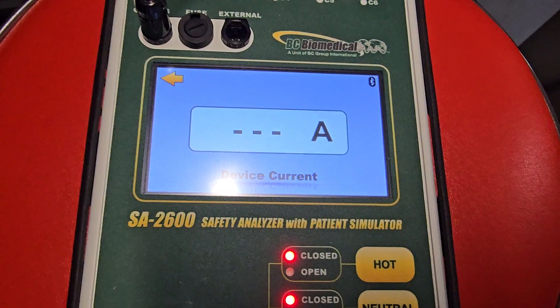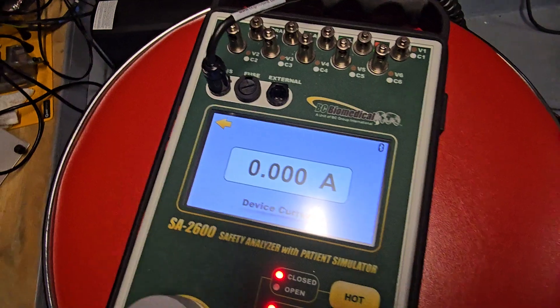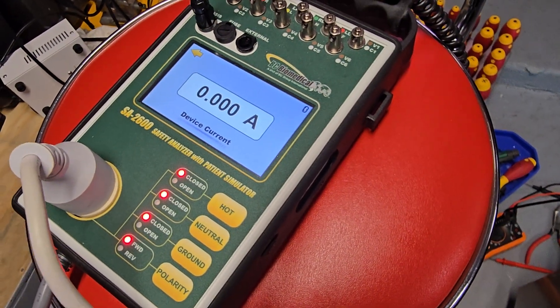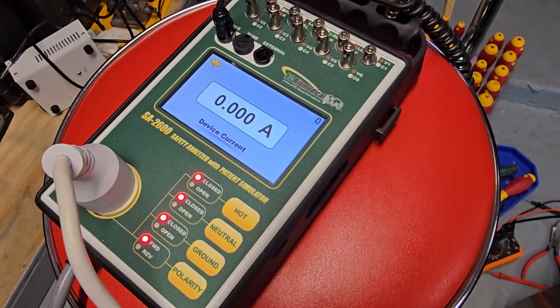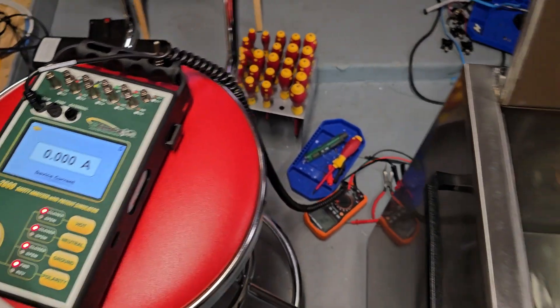Go down to device current and I use device current quite a bit whenever I've got a device that's questionable, it's not heating up correctly. If I have a motor that's making some weird noises you can use device current for a lot of things. I really dig that they put it right here on the main menu.